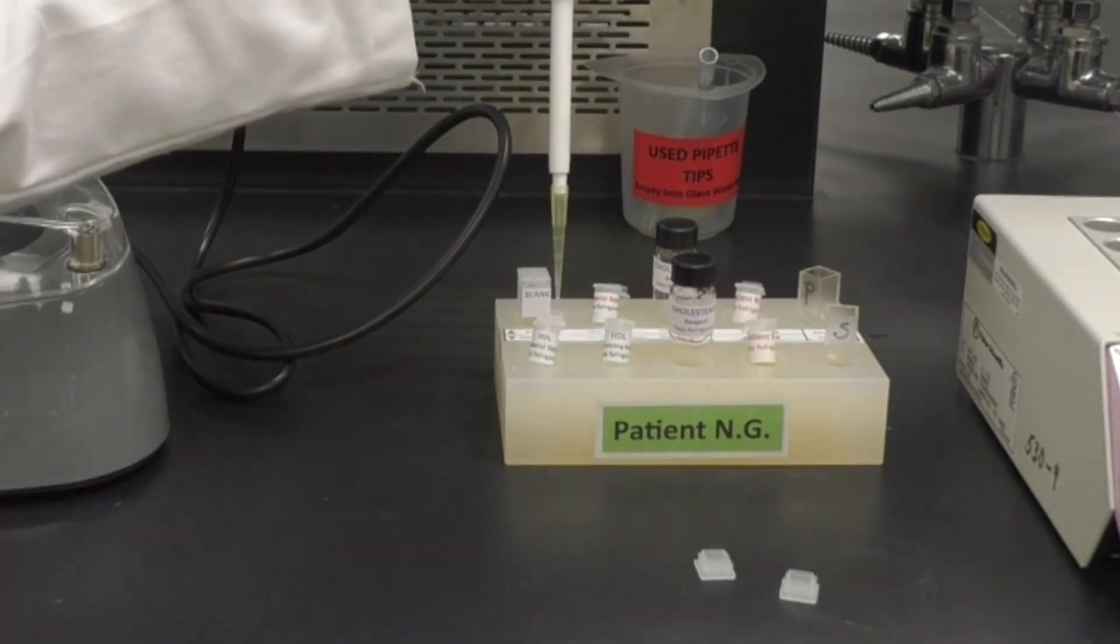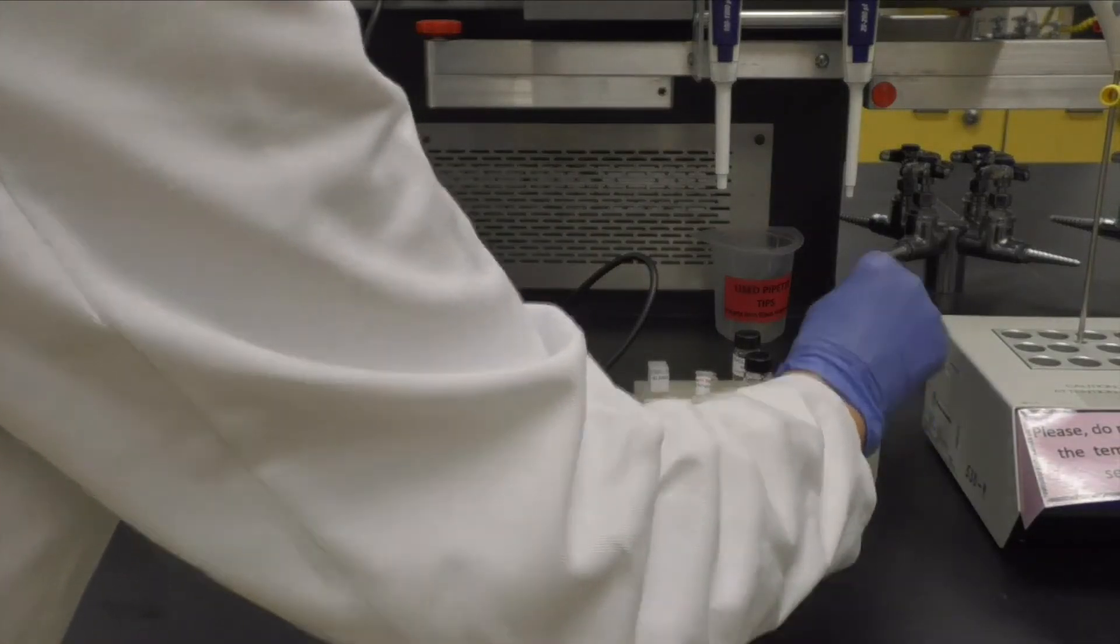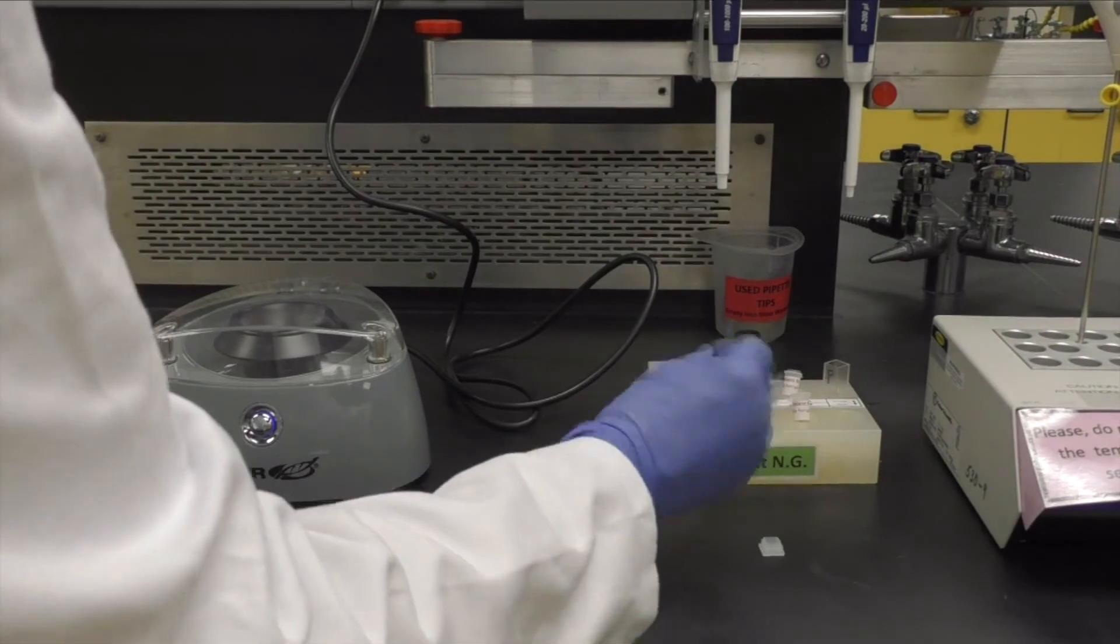Add 50 microliters of the HDL standard into the cuvette labeled as standard and rotate to mix. Place it in the dry bath for 5 minutes.